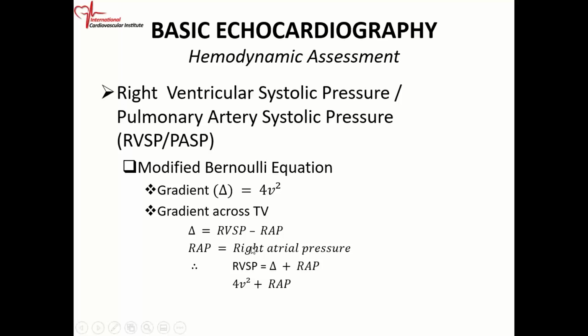One of the things that we calculate when we do echo is the right ventricular systolic pressure, or the RV systolic pressure.